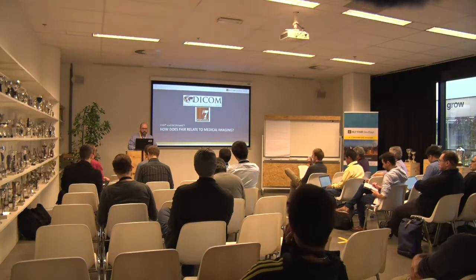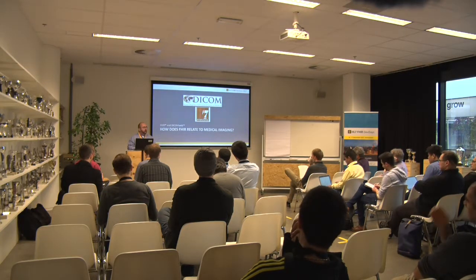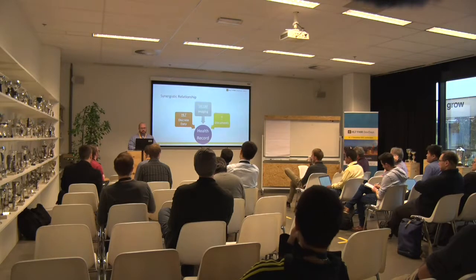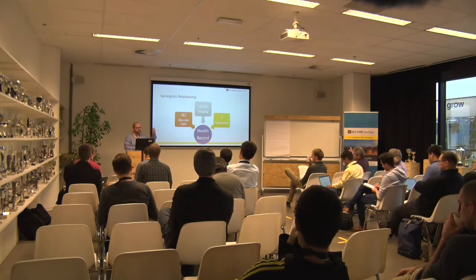So, looking at how FHIR relates to medical imaging, which is really important. We have FHIR, and how does this cross into the world of imaging? If we look at the synergistic relationship between HL7, DICOM, and I would say documents as well. What comprises the full clinical patient record is the discrete data, the imaging data, and the supplementary documents like requisitions, order notes, those sorts of things, discharge summaries.